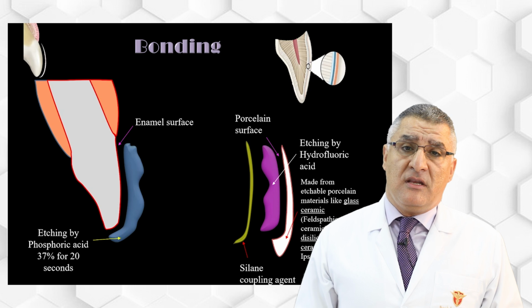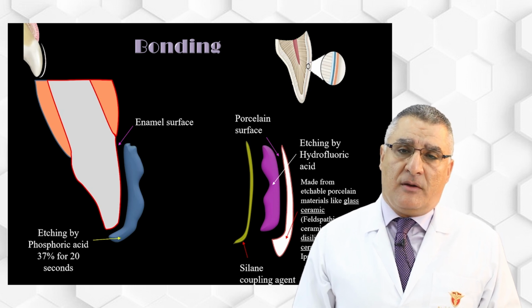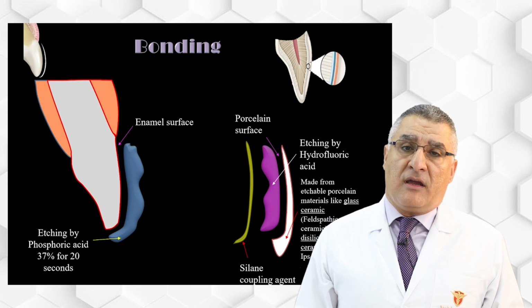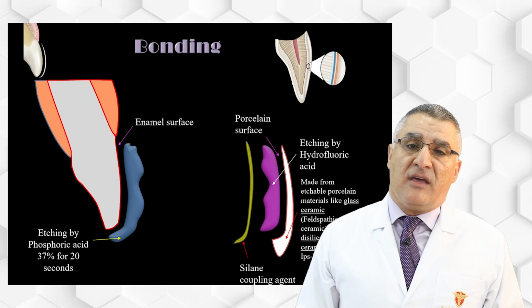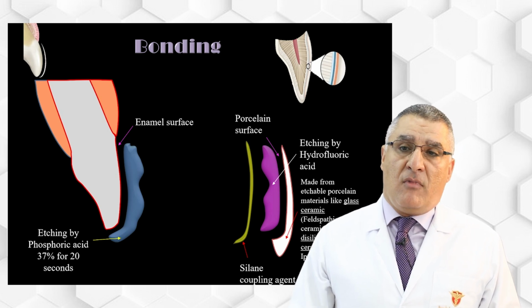Micromechanical bonding, we obtain it by etching the ceramic with the hydrofluoric acid, which gives me micro pores that will give micromechanical interlocking. And after that, we apply the silane coupling agent. The silane coupling agent will give me a chemical bond between the resin and the ceramic. So it is very important, chemical and micromechanical.